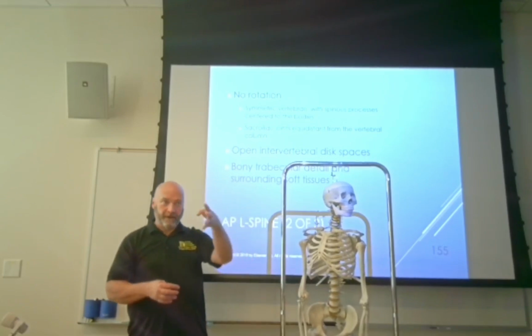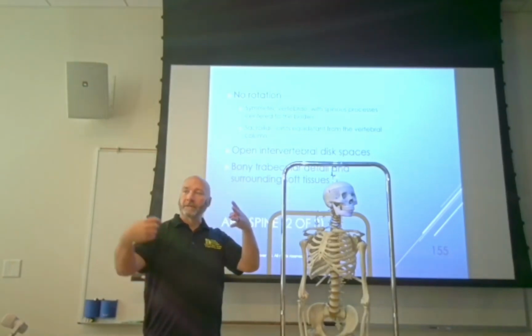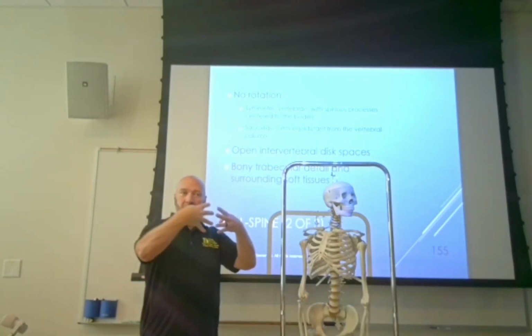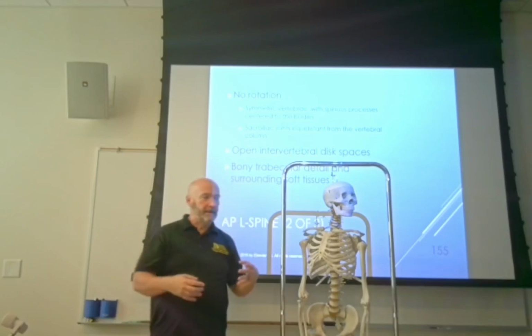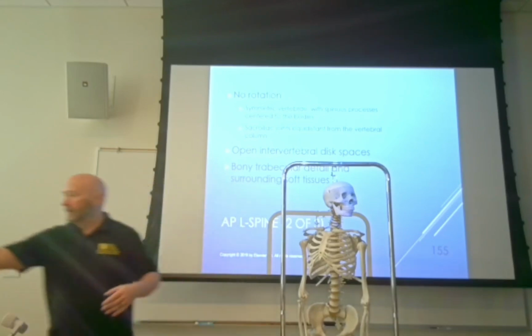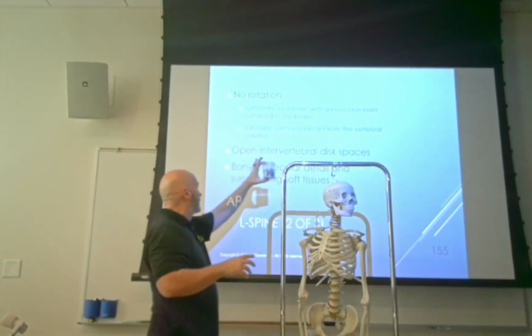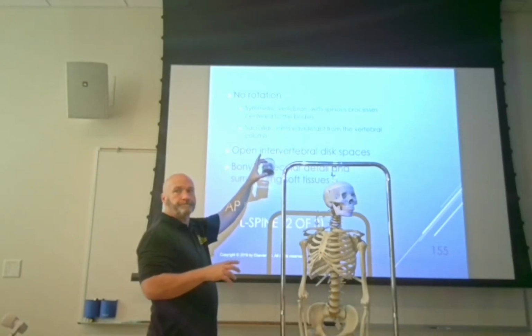So they're facing you like this: disc space, disc space, disc space, disc space. Central ray is diverging like this, okay? So they're not going to be parallel to each other, right? They're going to be bumping into each other. And what you're going to see then is, instead of the vertebra having that nice squared looking appearance like that, you're going to have some of that going on.